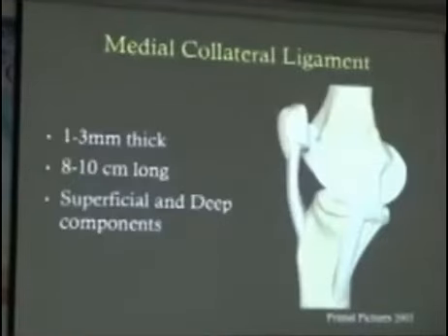So next is the medial collateral ligament. There's actually two bands of it, a superficial band and a deep band.